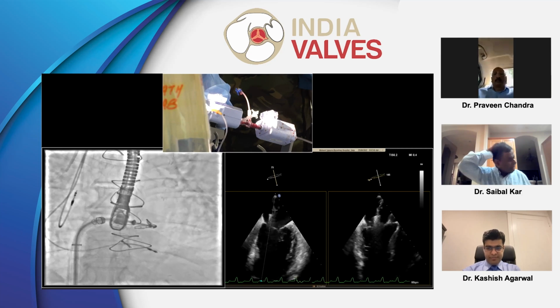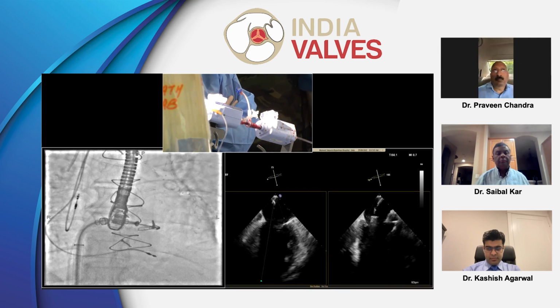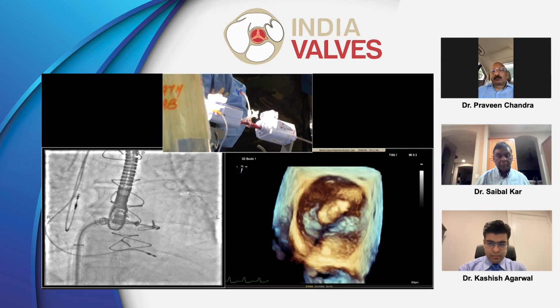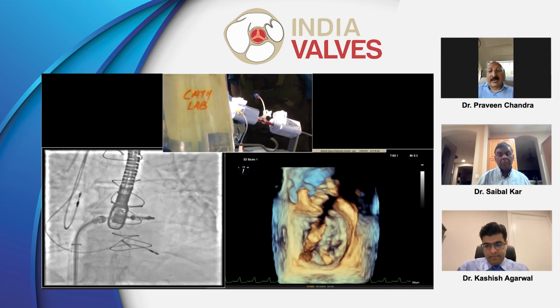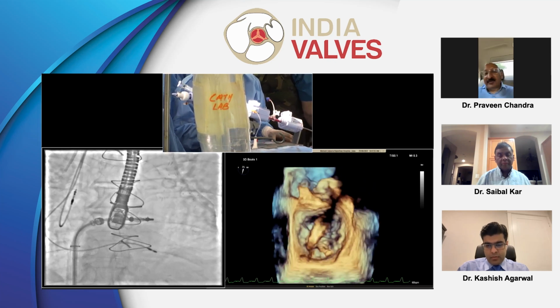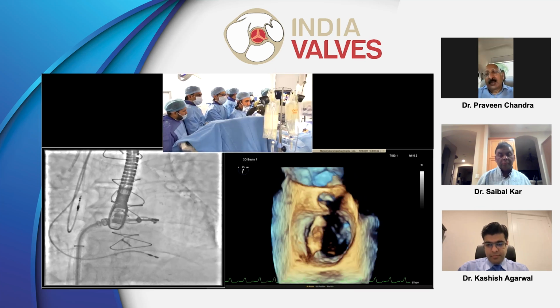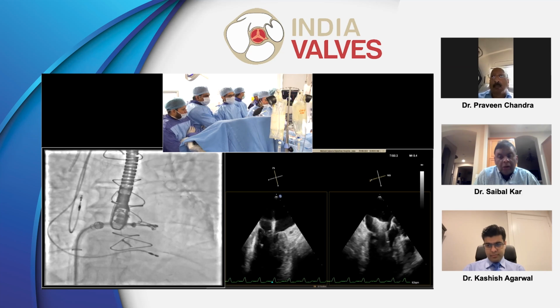It's opposite. 3D and fast, please. So this trajectory, you think it's... So for everybody's understanding, let me just tell everybody that now it's an interplay of the sheath movement, the whole device, and there are certain knobs, which are the movement knobs, which will help us actually position the clip in the proper position. Very, very lateral. Very lateral. It's a good position. Yeah. No, that's fine.